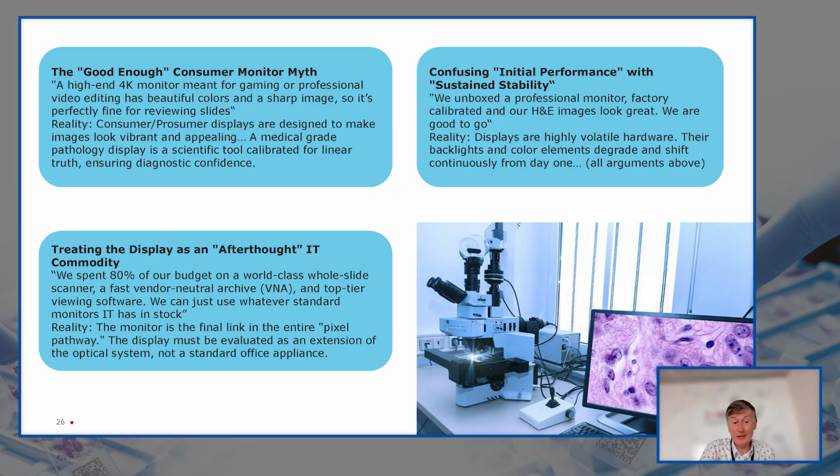But a medical grade display is a scientific tool. It's calibrated for linear truth, for diagnostic confidence over time. So these kind of just gaming displays are not built for that kind of purpose or usage.